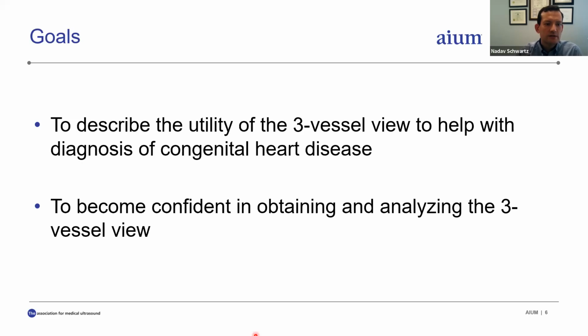Now, our goals here are to describe the utility of the 3-vessel view to help you diagnose congenital heart disease and to become confident in obtaining and analyzing this view in all of your scans. And we're going to do things a little bit differently. I'm Nadav Schwartz. I'm one of the MFM faculties here at Penn, but I'm partnering in this talk with Christina Worth, our lead MFM sonographer at the Hospital of University of Pennsylvania, and also our ultrasound clinical education coordinator, and Dr. Matt Jansen, who's one of our MFM fellows.